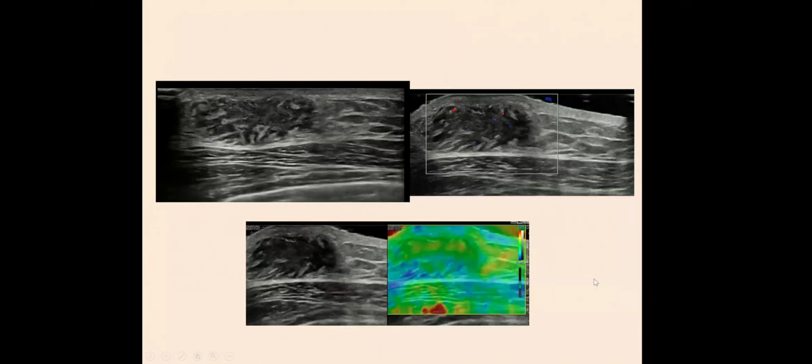One thing you should be aware of is that breast ultrasound is not limited to females. It's also done in males. And in males, one of the most common lesions that we detect on mammography is gynecomastia. And ultrasound is a very good tool for diagnosing gynecomastia.